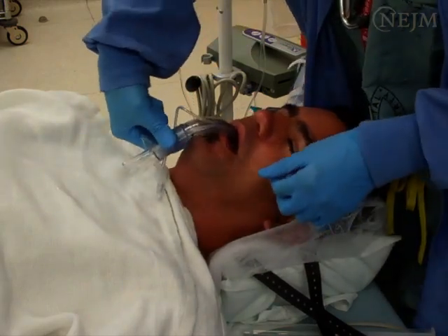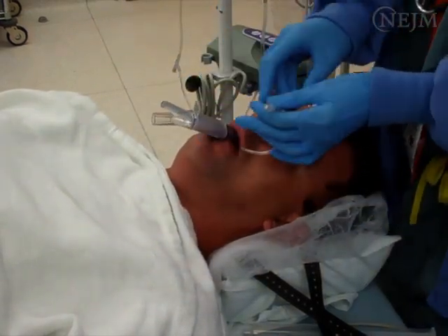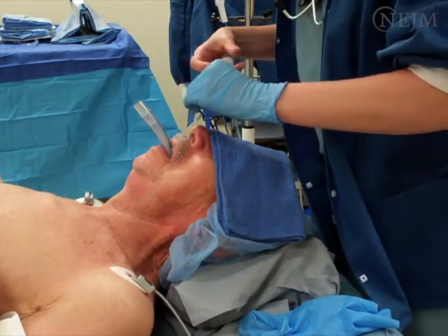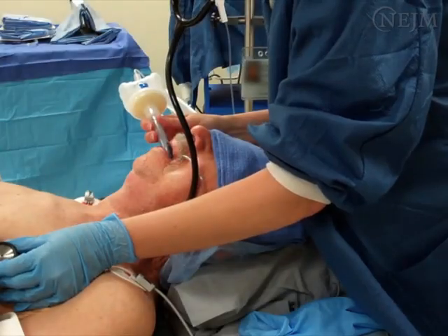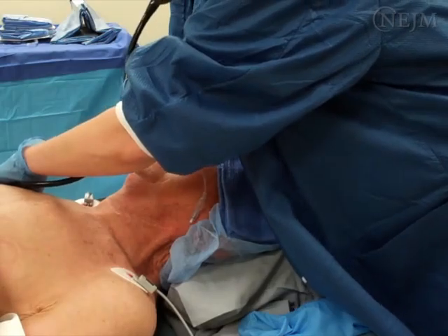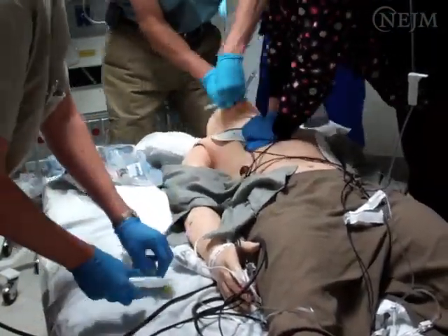Guide the tube behind the tongue and toward the larynx with a circular motion of the hand. After placement, inflate the cuff and then connect the device to a positive pressure ventilation system. Confirm proper placement by auscultation of breath sounds. Auscultation of breath sounds should take less than 5 seconds, and placement of the laryngeal mask airway during resuscitation should not require interruption of CPR.